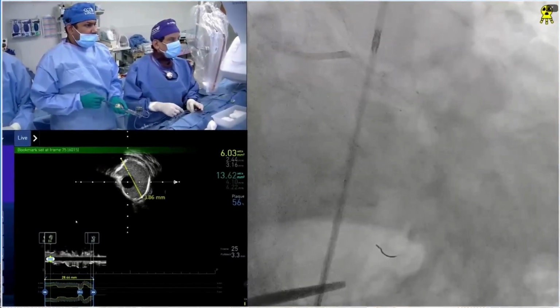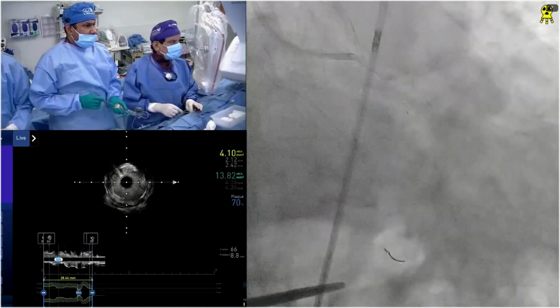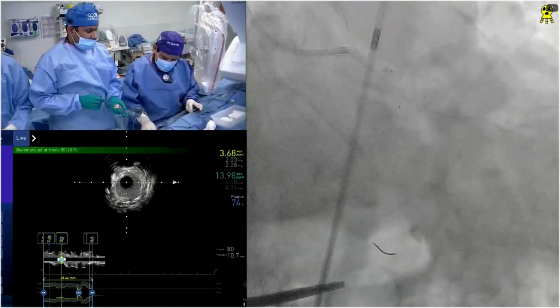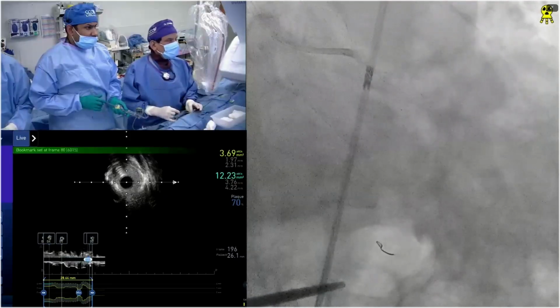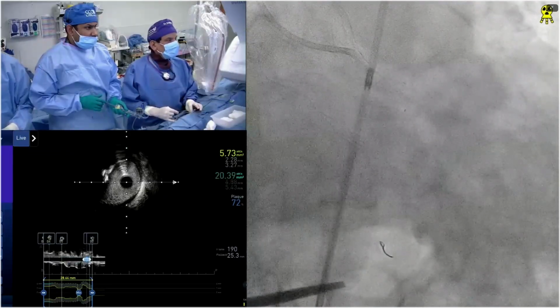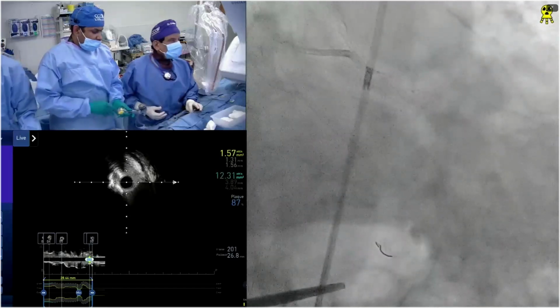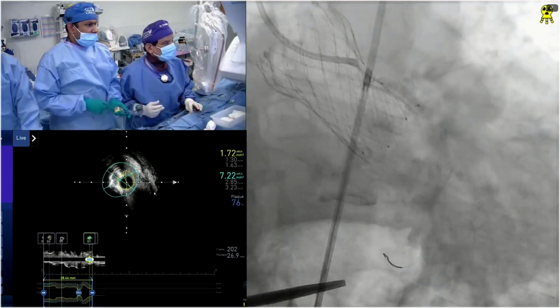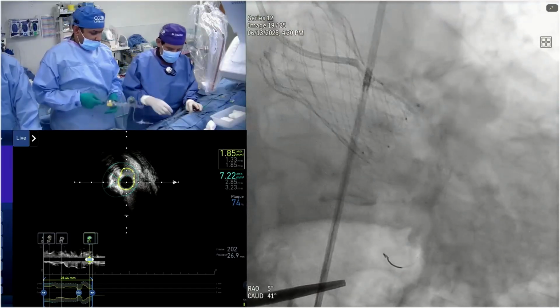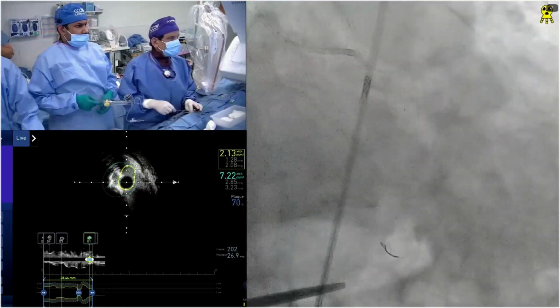Correct. Now, the plan is to stent the distal left main or just the ostium of the circ? Yeah, to me, our plan is distal left main to the circumflex now. Correct. Based on the lesion, because LAD is borderline for this patient. Go on. That's it. It's a great example. After the balloon and IVL, tell us if anybody else feels differently. It's just a great example of how limited you are when you don't have that alignment that allows you free entry into the left main.